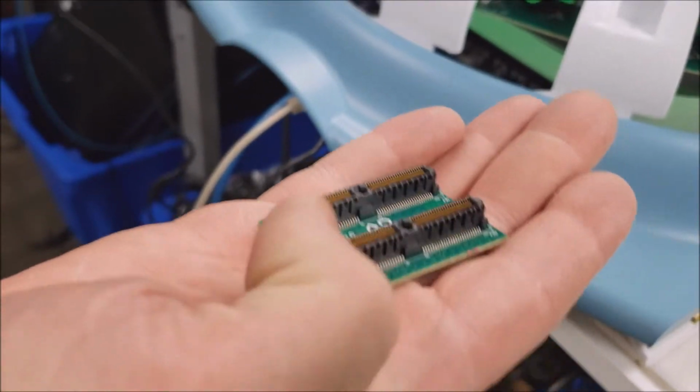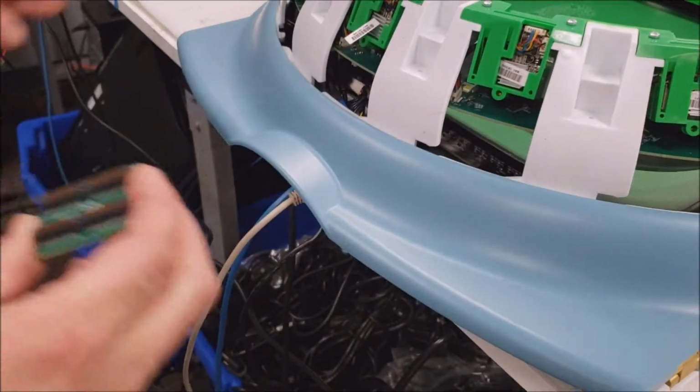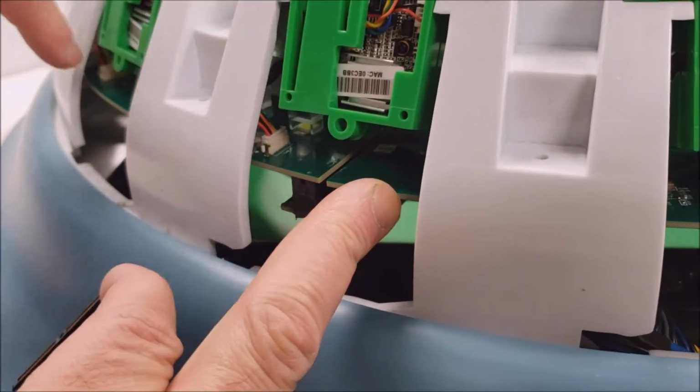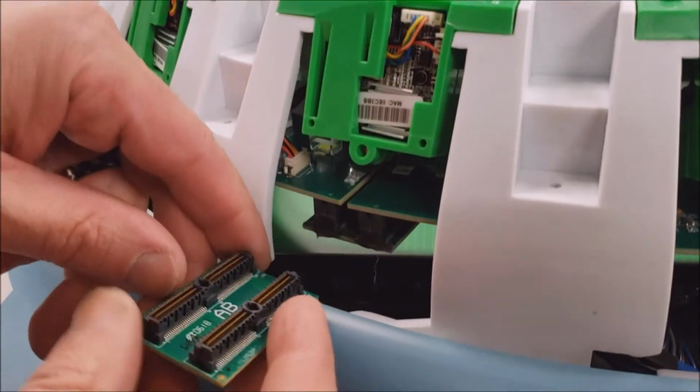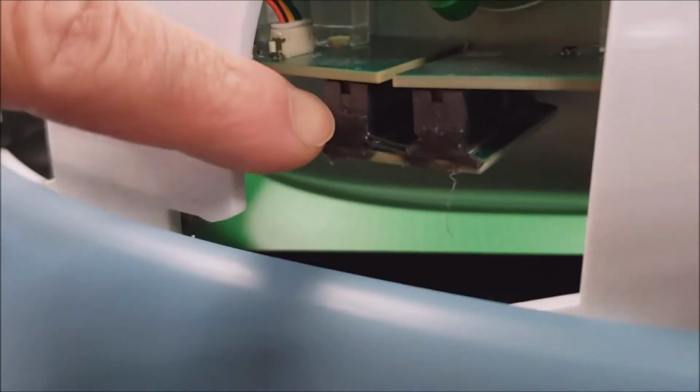This is a bridge clip. This is part of your Albert scanner. What it's for is to connect these two portions of the boards that connect all the cameras around. This fits in underneath. It pops in like a Lego.